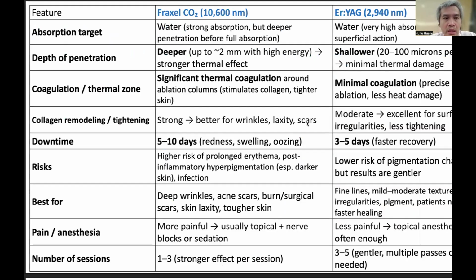The CO2 laser has a strong energy, so the depth of penetration is deeper compared to the Erbium YAG, which is a bit shallow, and the coagulation also. CO2 laser coagulation is significant, and the Erbium YAG has minimal coagulation effect.